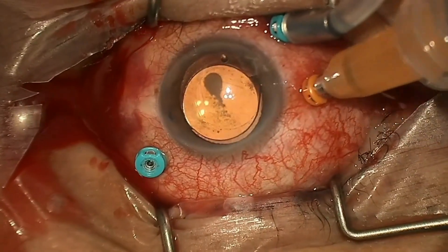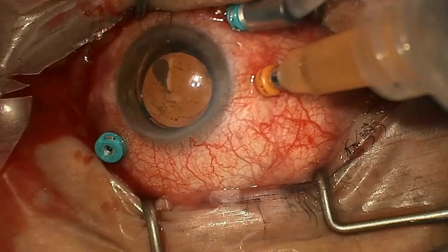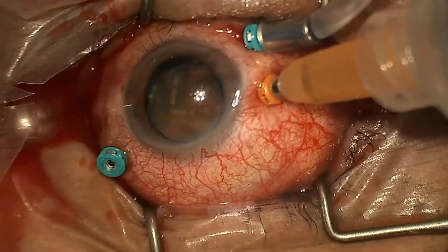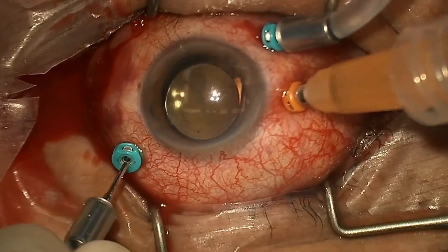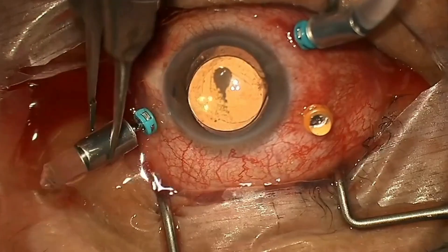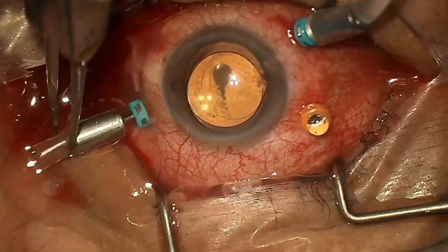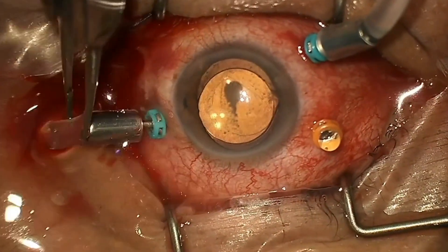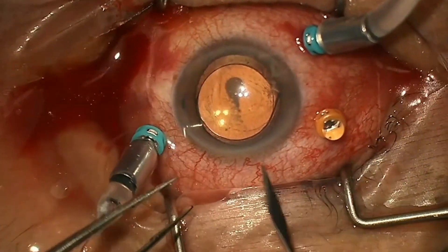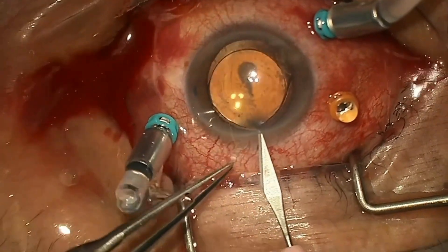So this patient is undergoing oil removal. It looks like a hybrid setup — a 23-gauge cannula for the oil removal and 25-gauge for the others. Do you do much hybrid vitrectomy? For oil removal, I ask for 23-gauge — I like speed and efficiency to get that oil out.